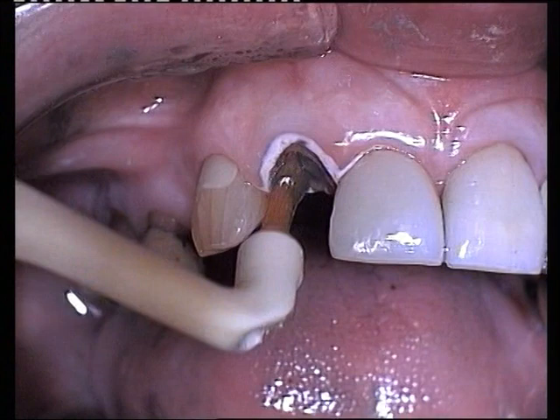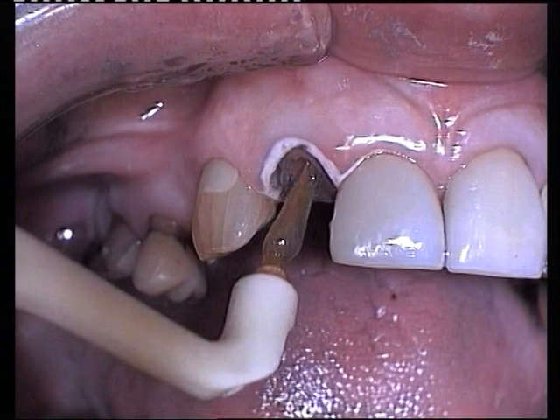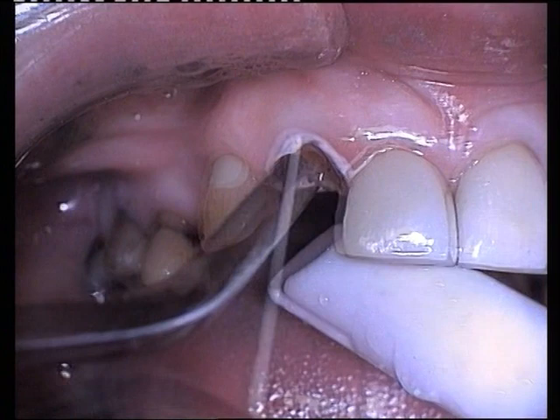The preparation is etched with 37% phosphoric acid for 10 seconds, washed and dried with oil-free air. A paper point is inserted into the base of the canal to ensure that all moisture has been removed.